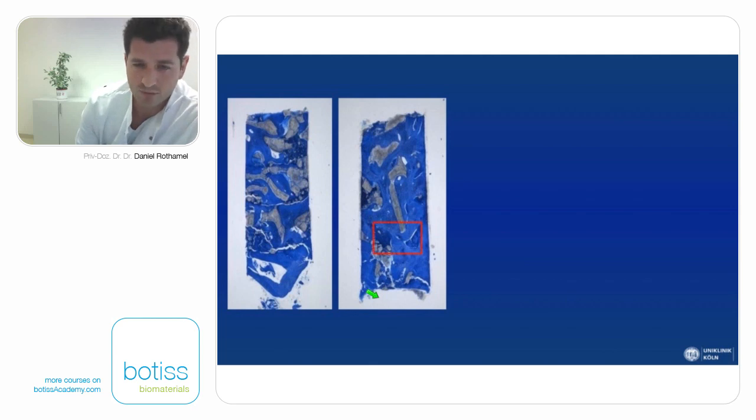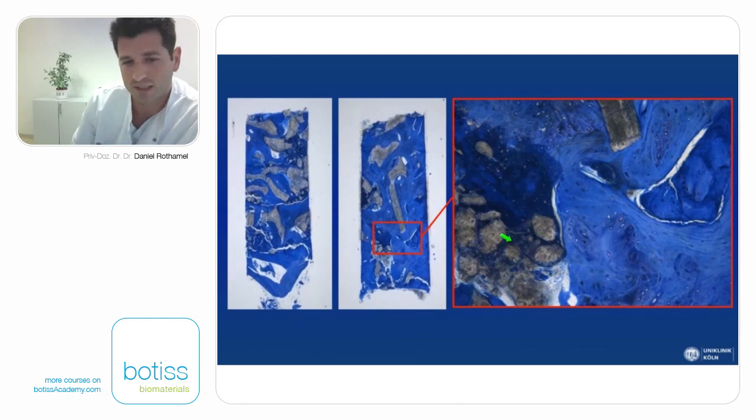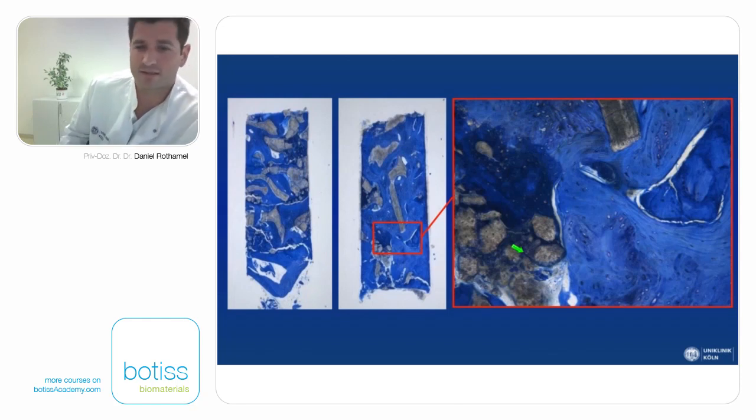But there is another very interesting aspect when we compare it to the bovine bone substitute materials. When we look at this area in a higher magnification, you can see that this particle is starting to be remodeled completely, meaning that this material is not lasting forever regarding resorption and bone remodeling. It's more the case that this material will just disappear within 2 to 4 years probably, so that after 4 years this material has turned over into vital bone matrix. So if we want to have only the patient's own bone after a long healing period, probably this would be the material of choice for sinus grafting procedures.